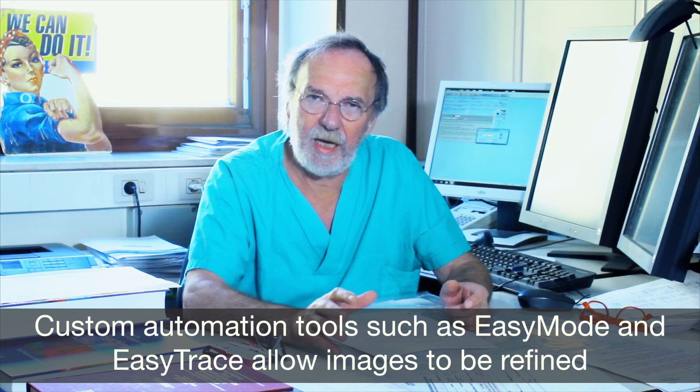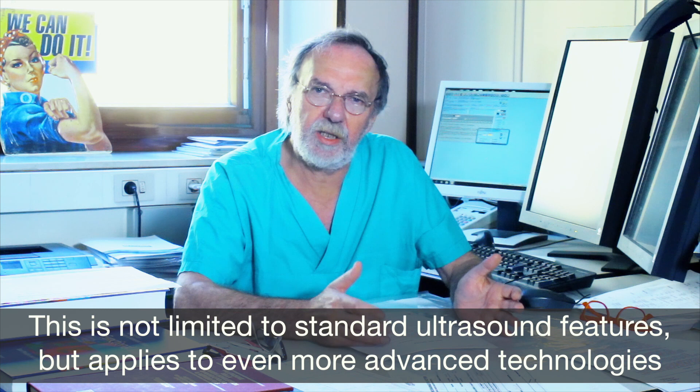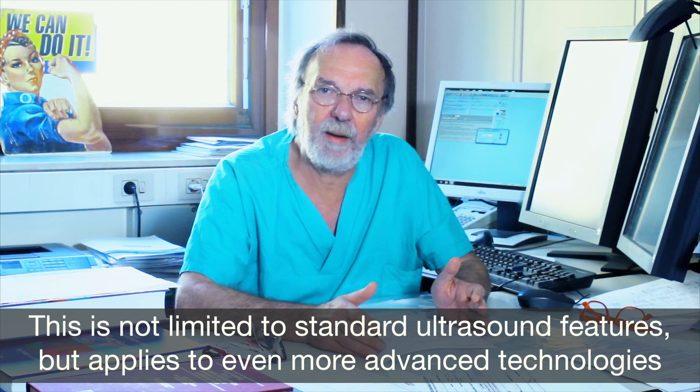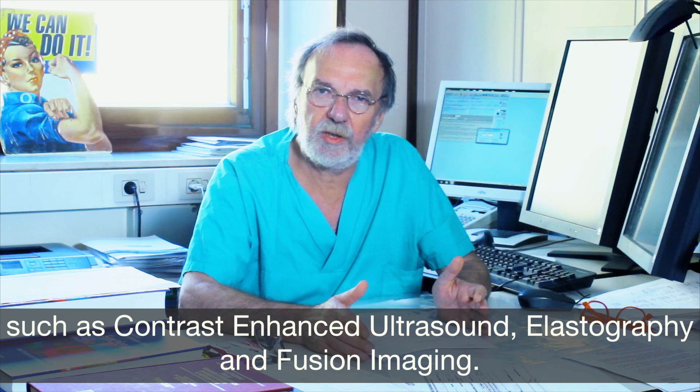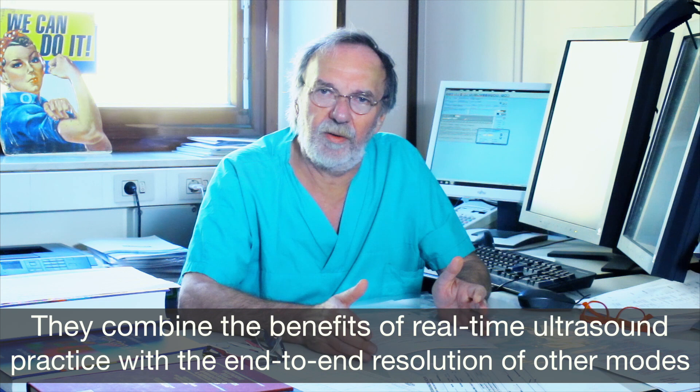Custom automation tools such as Easy Mode and Easy Trace allow images to be refined according to each physician's needs, taking full advantage of the performance of the unit. This is not limited to standard ultrasound features but applies to even more advanced technologies such as contrast-enhanced ultrasound, elastography, and fusion imaging, which combine the benefits of real-time ultrasound practice with the end-to-end resolution of other modes.